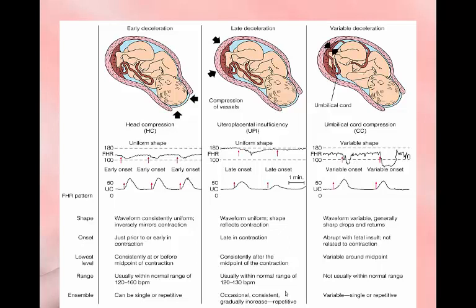When we see late decelerations, this is when we really need to be thinking about our nursing interventions, okay? We're going to do something called intrauterine resuscitation. So usually the key steps in intrauterine resuscitation are going to be if the patient is on any type of induction or augmentation method, which is usually going to be IV oxytocin, or Pitocin, you need to turn the Pitocin off. You don't want to be doing anything else that is going to cause stress to the fetus. And then the other things that we typically are going to do, change the patient's position, especially if she's laying flat on her back. You need to get her over, get her on her side, get her off of her back. We're going to give an IV fluid bolus.